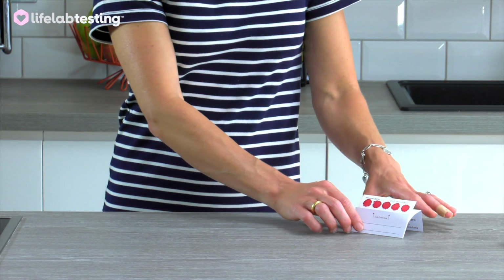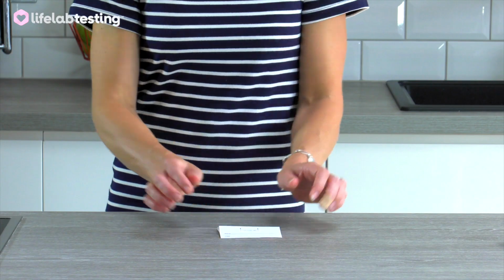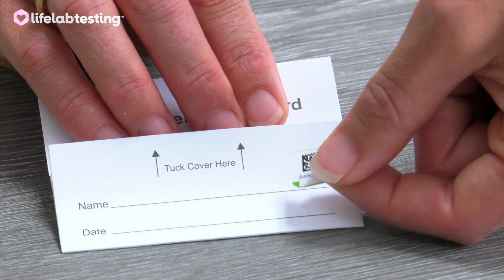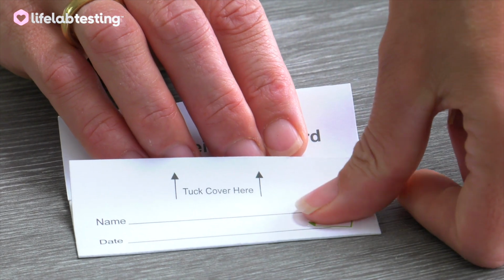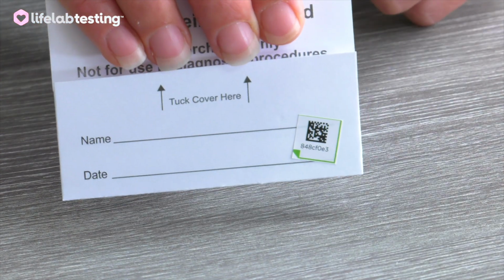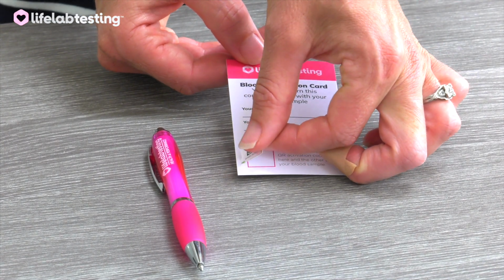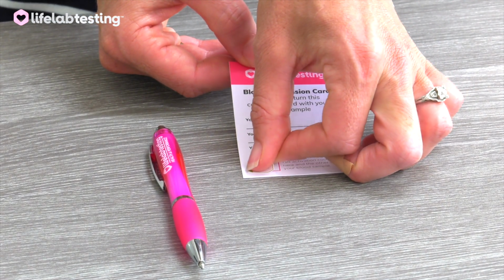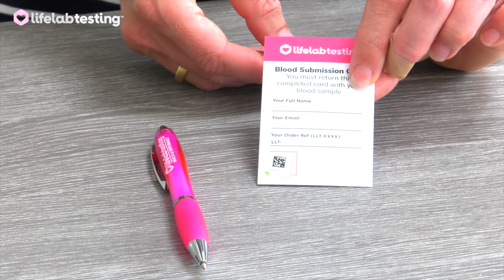When the sample is dry, fold the cover over the sample and tuck into the bottom flap. Remove one of the adhesive labels from the activation card and fix it to the blood spot collection card next to your name and date details. Remove the other adhesive label from the activation card and fix it to the blood submission card. Please also fill in your name and email details.